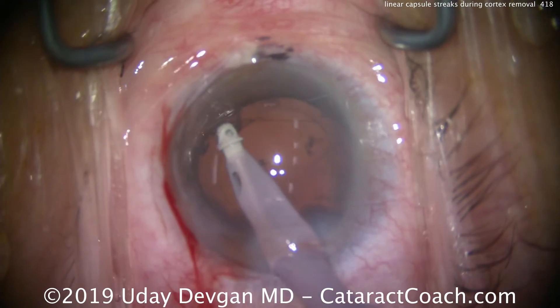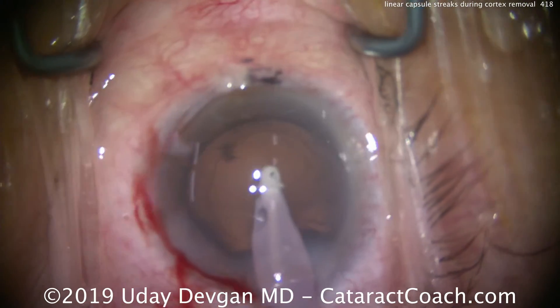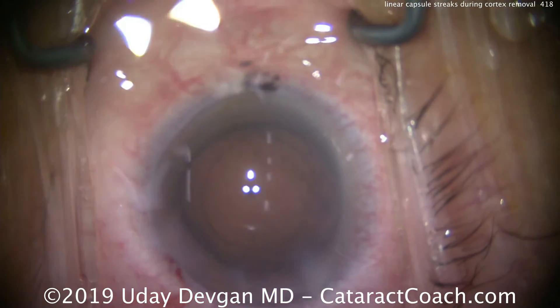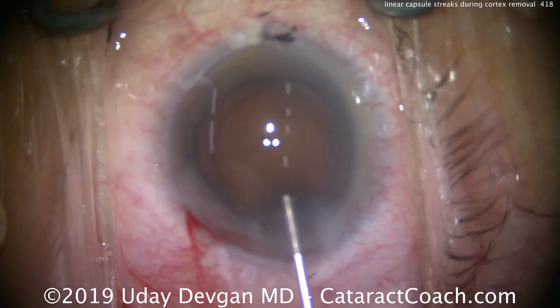So I back-flush and let's try again. It turns out these linear streaks are not ruptures in the capsule — it's just stringy cortex, an unusual type of change that tends to happen in very elderly patients. So we're lucky. Everything went fine. The capsule is intact. There is no breakage.